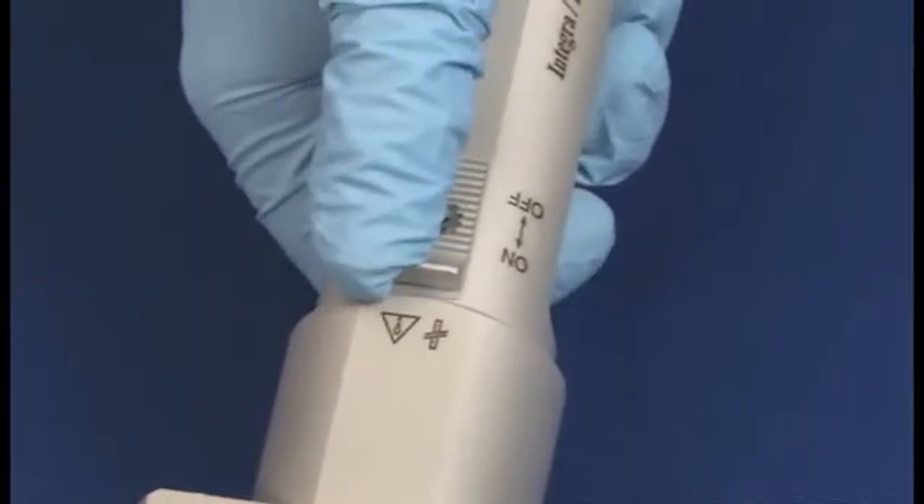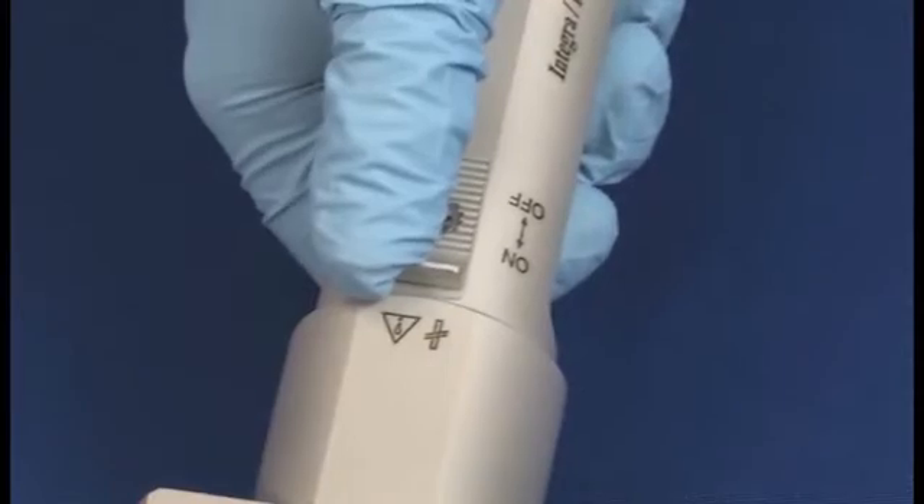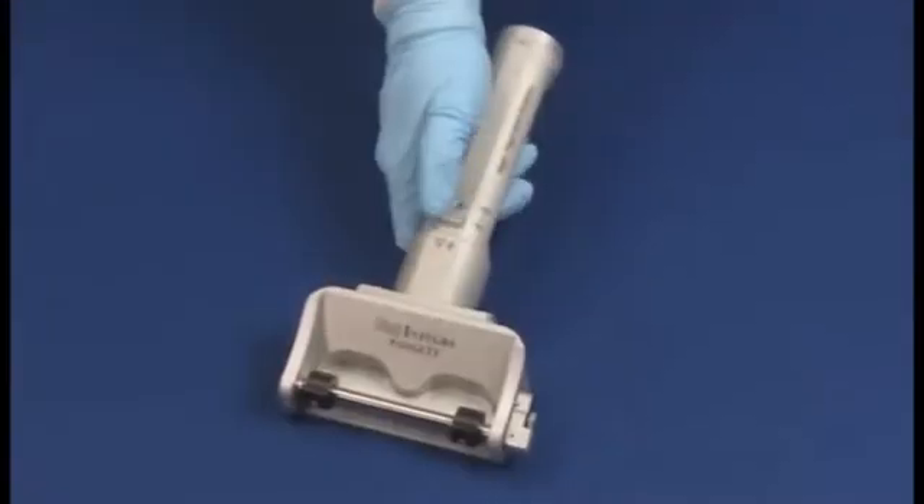The switch must be held in the on position, except for special models designated for tissue banks.